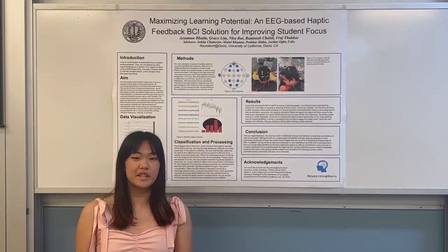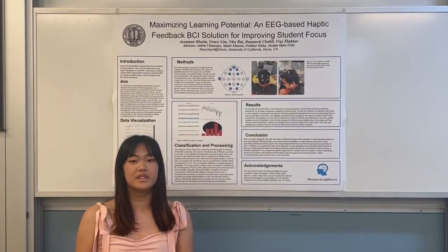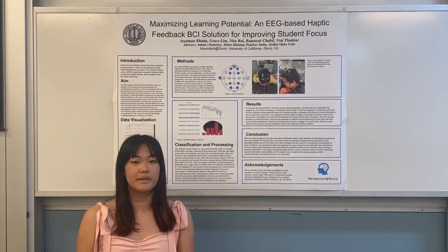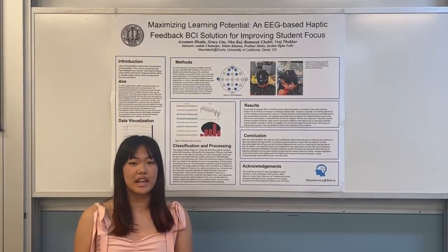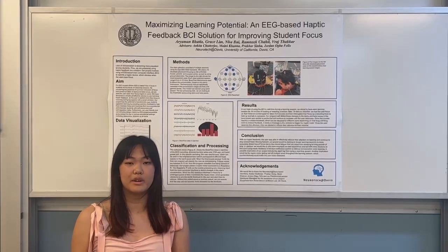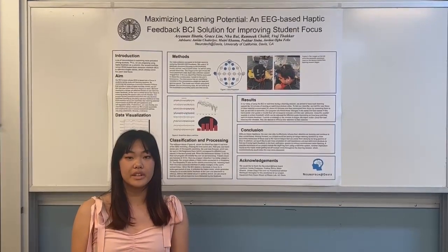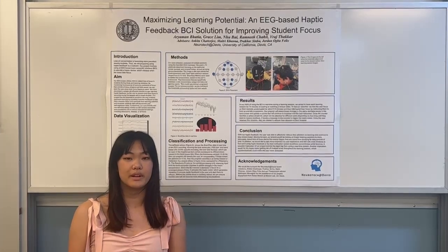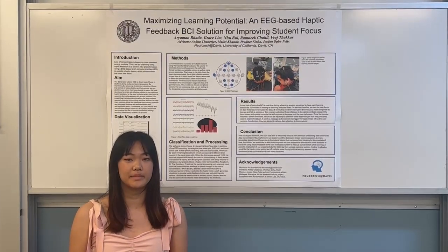Now I'm going to be talking a little bit about our data streaming. We use the Python library MNE to visualize and analyze our data straight from the EEG itself. Doing this, we can look at our recording and get rid of any noise by applying a low bandpass filter. Since MNE doesn't work in real time, we also use a library called BrainFlow in order to process our data in real time, as well as work with our classifier.